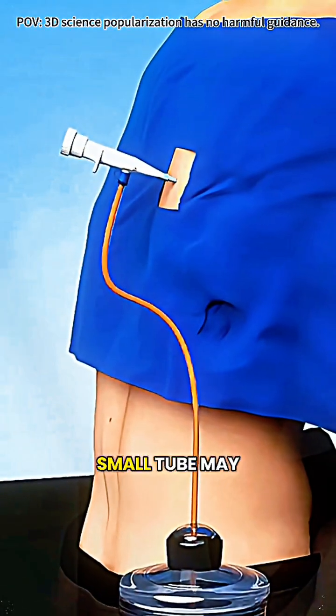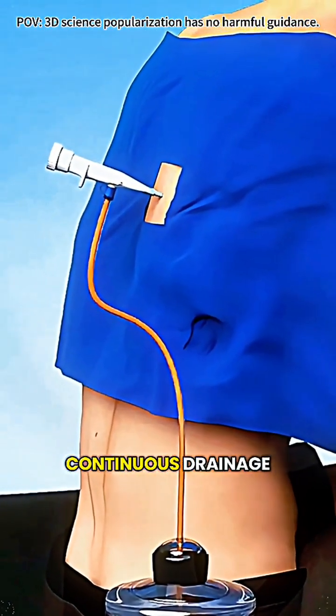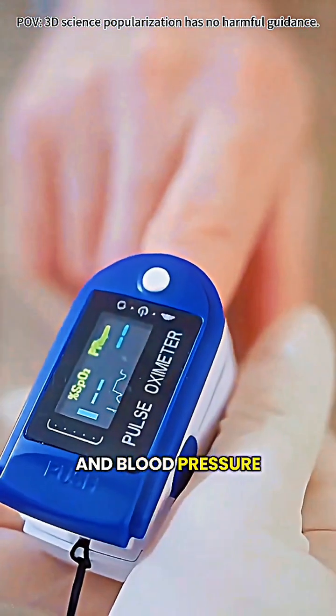If there's a larger amount, a small tube may be connected for continuous drainage. Staff monitor breathing and blood pressure to ensure safety.